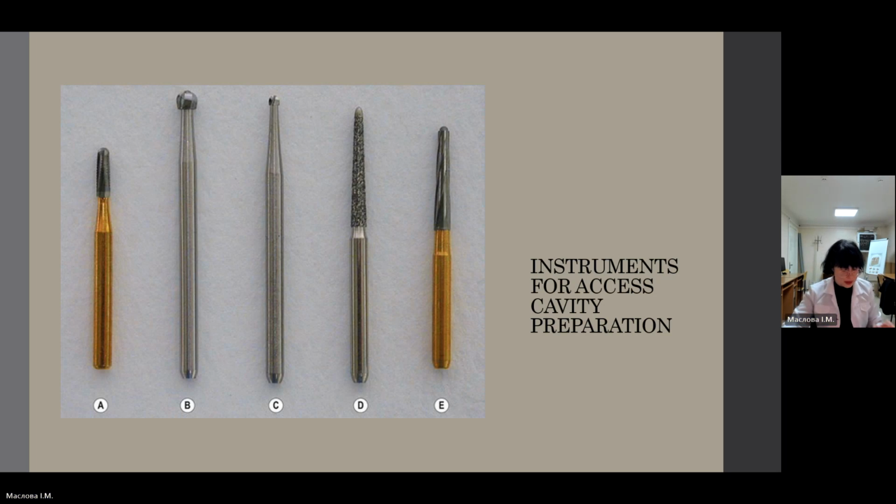preoperative radiograph. If there is vital pulp tissue, remove the coronal pulp with the excavator and the radicular pulp with broaches, and irrigate with sodium hypochlorite, as good visibility is important. The dentist has to stop and take a radiograph of the canals. Place an endodontic explorer in the hole you have prepared, ask the patient to bite on it and take radiographs, so that original anatomy and foramen position are maintained. The apical foramen should also be kept as small as practical.